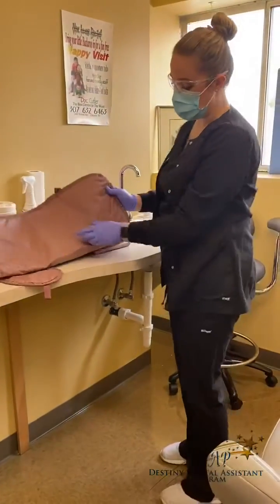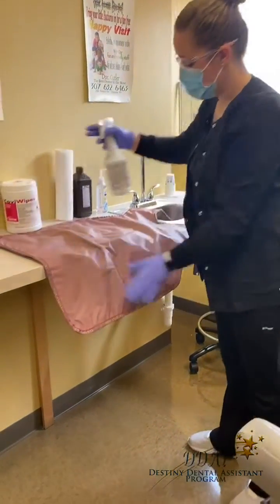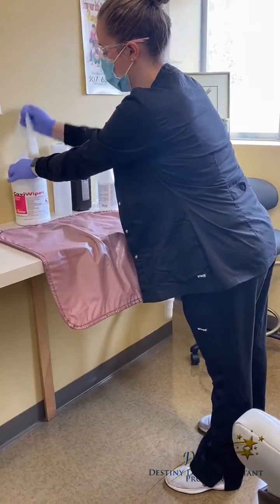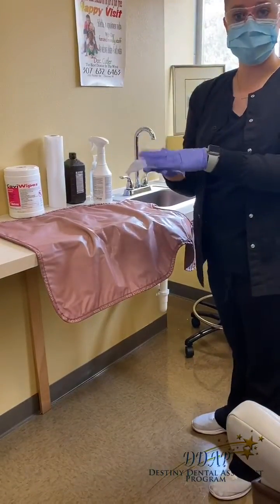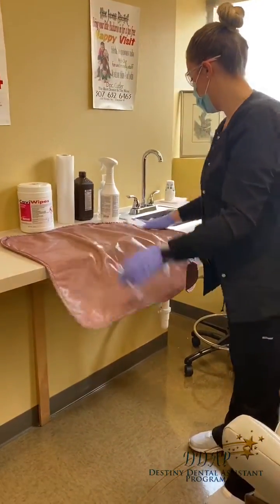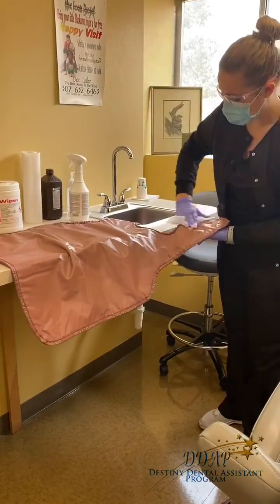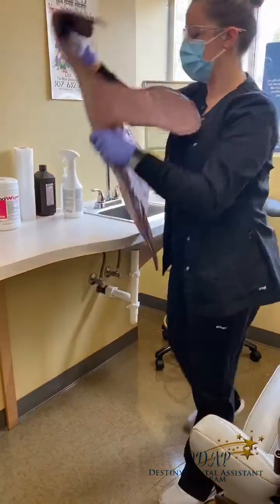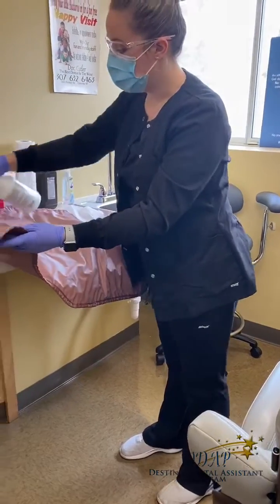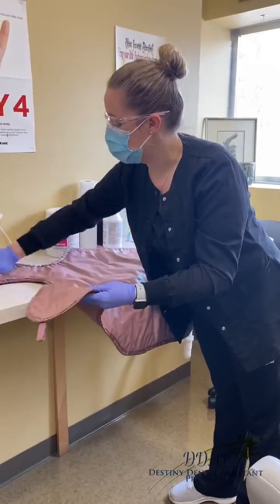We'll start with the lead apron that has been over the patient. I usually like to lay it out a little more. I spray one side and then take my wipe, put it in my hand so I'm not fully contacting, and wipe it down, making sure I get all the way up to the corners as well. I then flip it over — one side was obviously touching the patient, and the other side was out in the open, but there could have been contact with saliva, blood, or anything on that side. So we'll wipe down both sides.